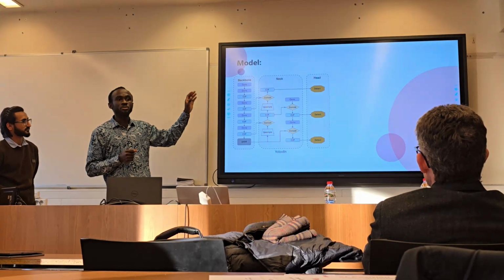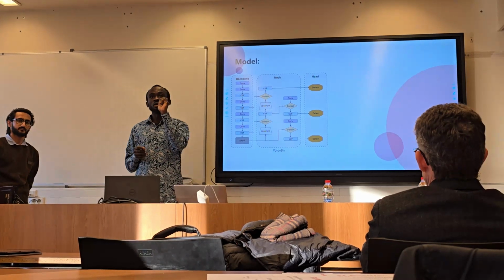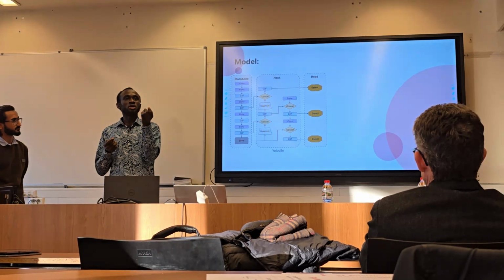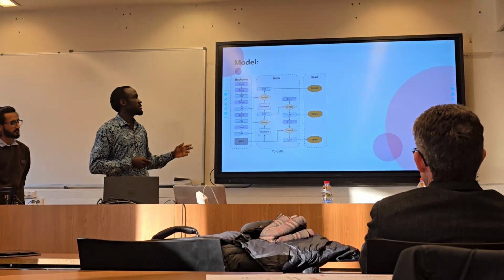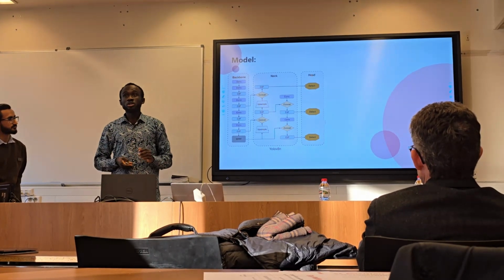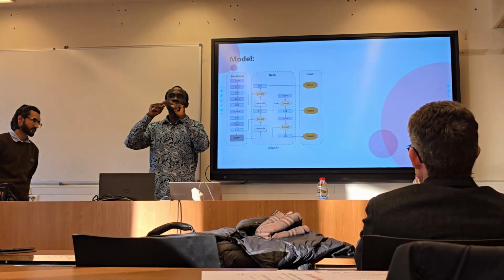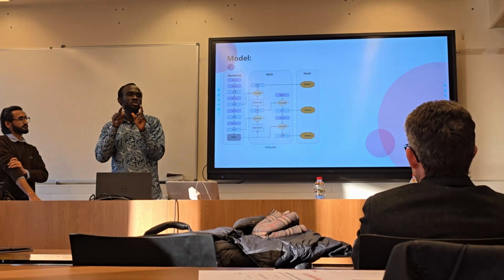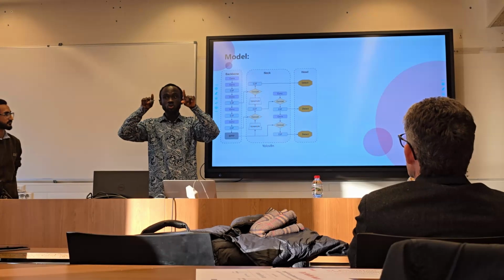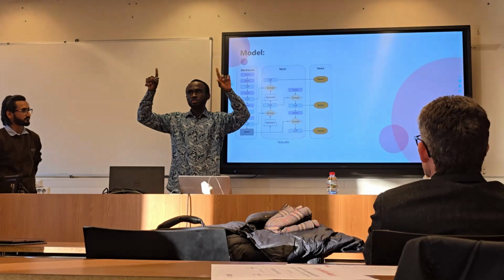We have the backbone, which extracts the features, and the neck, which takes those extracted features and tries to enhance them, and the head tries to do the detection and classification. Among these stages, at the head, these two versions can consider these size variations. It can work with small lesion detection, here is the medium, and here it can have a higher bounding box.